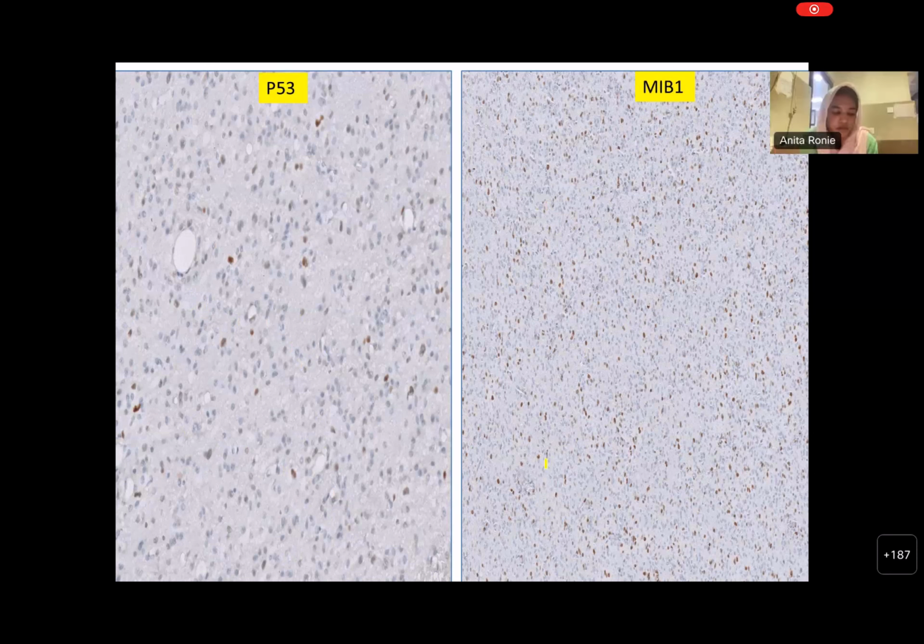So at this point of time, what exactly are your differentials? It must be glioblastoma, wild type glioblastoma. So you had 2 differentials here because of the 3 groups. One you could exclude. It is definitely not IDH mutant astrocytoma because ATRX is not lost. That's out. Between these 2, you cannot distinguish between oligo and this based on IHC findings. But morphologically, you felt it is more of an astro, right? That's the feature which goes negative for oligo.